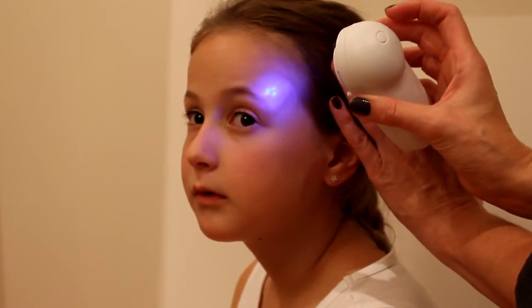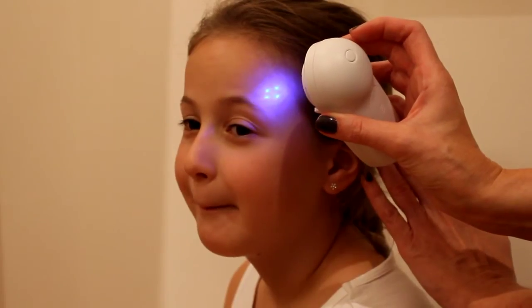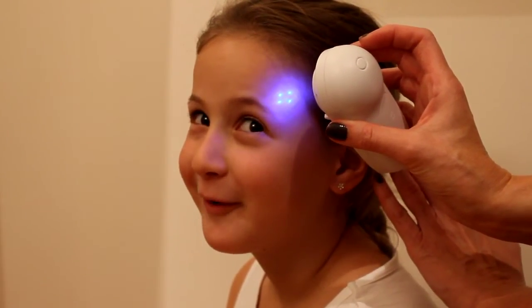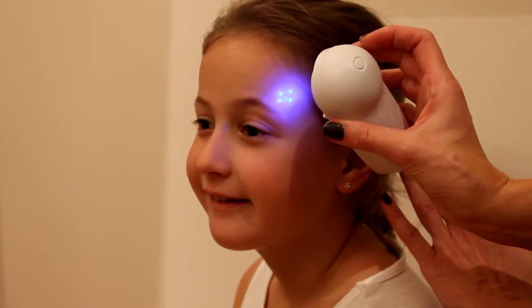Position the blue ray on the temple. Ensure that you can see the dots clearly — four dots will appear. This ensures that the thermometer is at the correct distance from the temple.